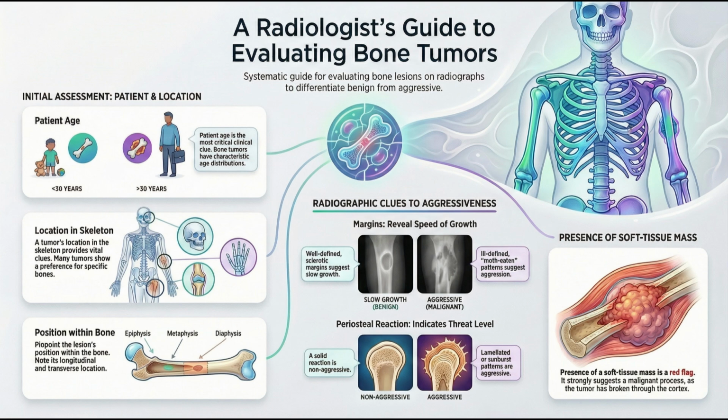And the third type, ground glass matrix. The source calls it hazy or frosted. That's our signature for fibrous dysplasia, isn't it? Exactly. It's subtle but distinct. The bone structure looks hazy, like looking through frosted glass. And finally, if there is no visible matrix, just pure lucency, the tumor hasn't produced any recognizable calcification. That often points toward metastases, lymphoma, or Ewing sarcoma. Okay, so we've analyzed the substance and the tissue type. Now we need to determine its behavior.